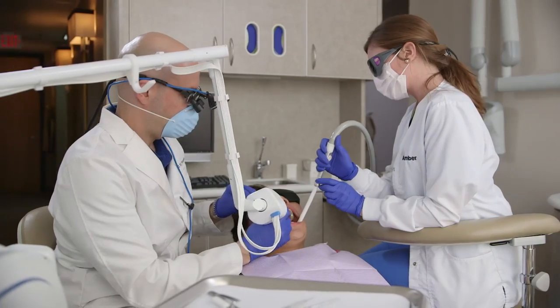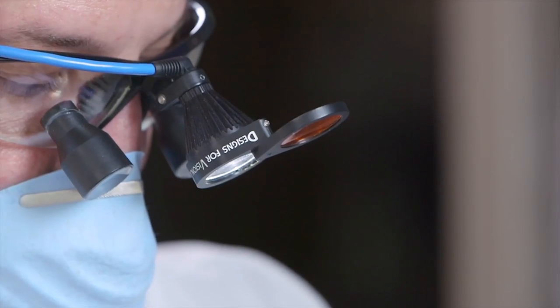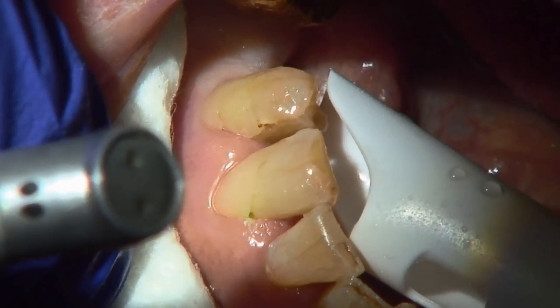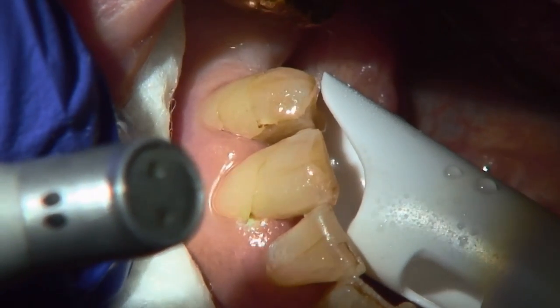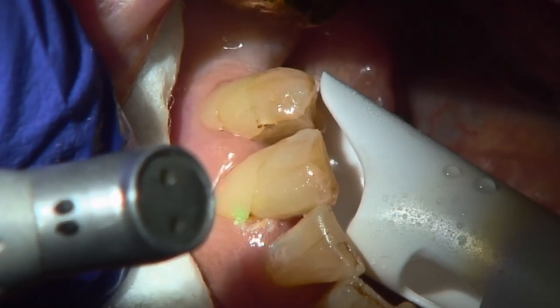I use Solea just about on every patient every day, and it comes down basically to patient experience. I do general restorative dentistry, class 1 through 6s. The dramatic part about the class 5 is not its depth of decay or necessarily the position — it's the management of two tissue types with Solea seamlessly without anesthetic and without bleeding.